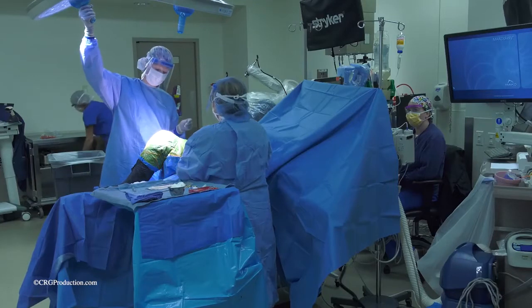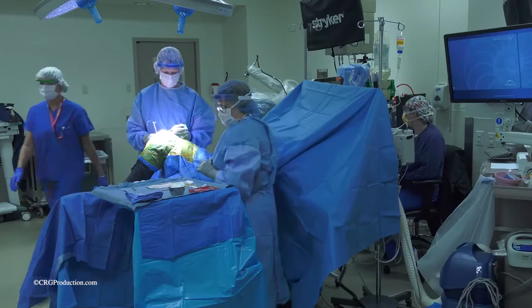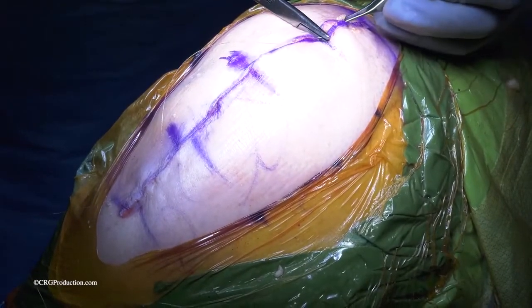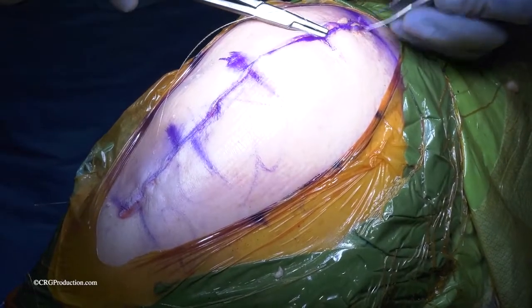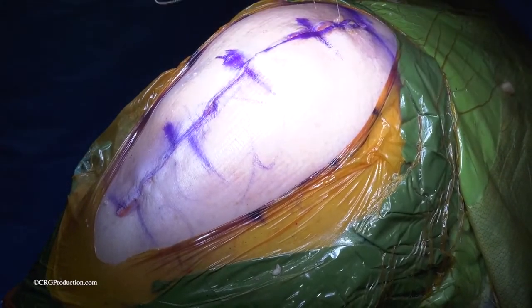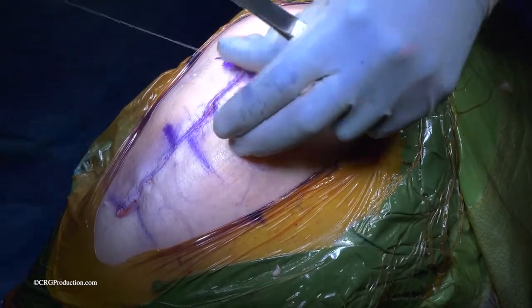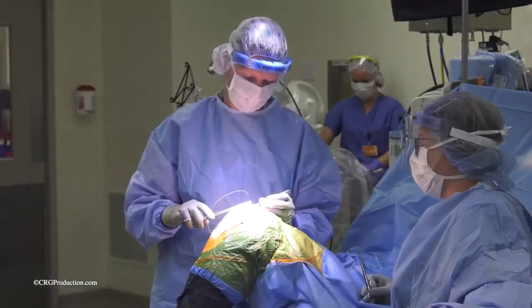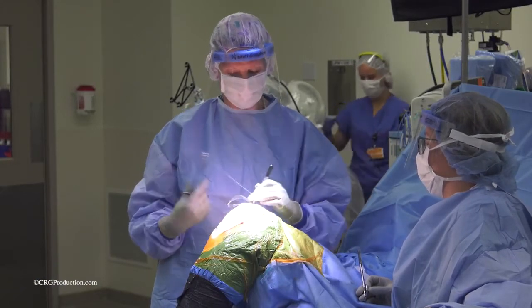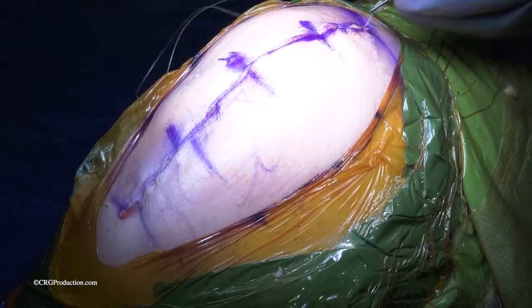That being said, the first phase of recovery seems to be 2 to 3 months after surgery. For some people, it seems to be 2 months, and other people, 3 months to get back to your normal activities once again. I do have patients concerned that their knee will open up after we do the surgery when they bend it too far. And you'll notice with this suture material, it has small barbs on it that help hold the skin edges together. And again, this has worked great without any problems.